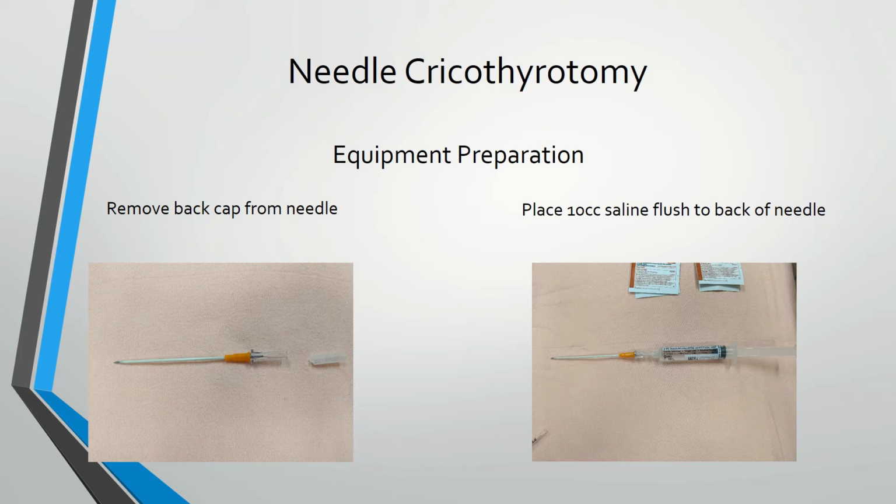That's the nice thing about these IV catheters. If you have one of the safety catheters, regular IV catheters, you don't have that ability. So you have to skip the step of the 10 cc flush and just verify your placement another way.